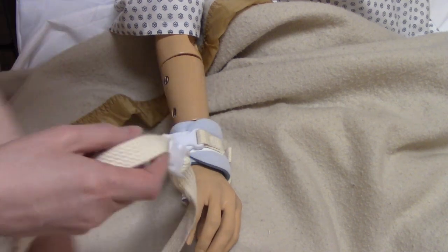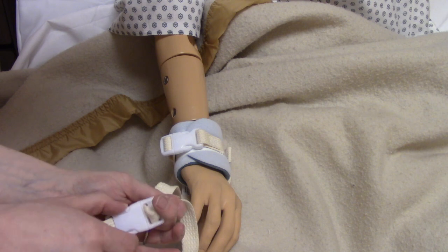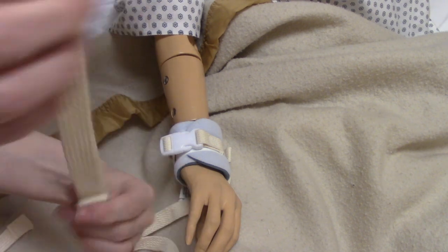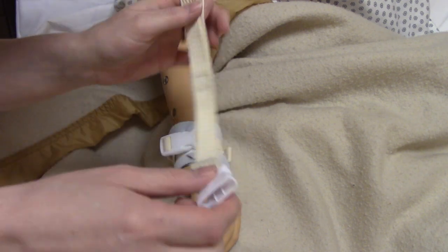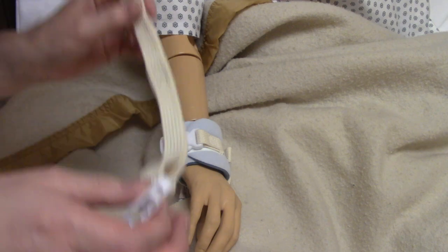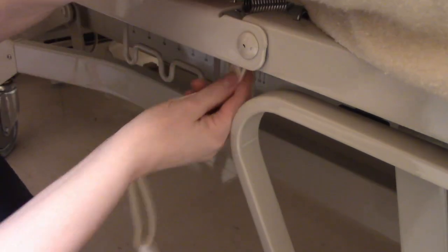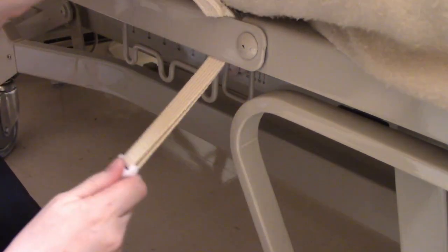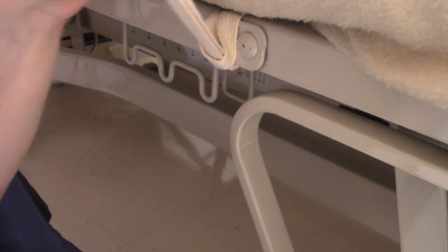The next thing we need to do is attach this part to the bed. So we unbuckle this and now we have a separate strap that we're going to attach to the bed frame. It's very important that we attach this to the bed frame and not the side rail. You see how it has a little loop end and a buckle end — you go here and then hook that through so it's nice and tight.